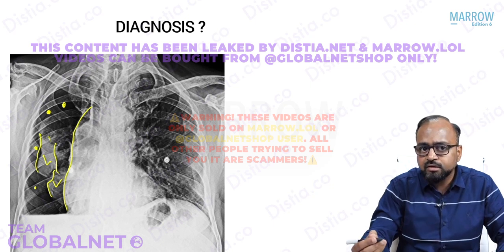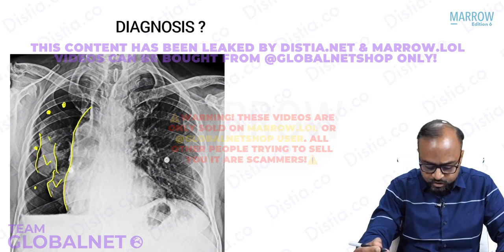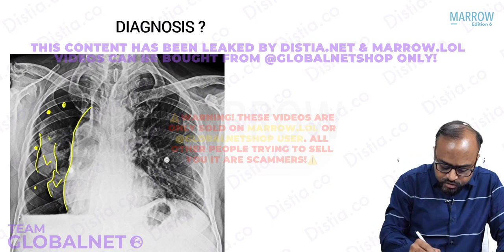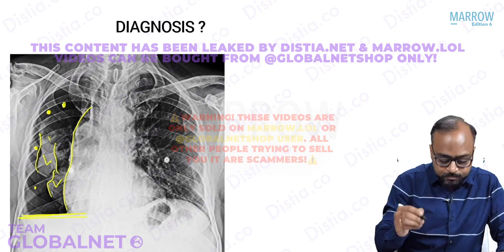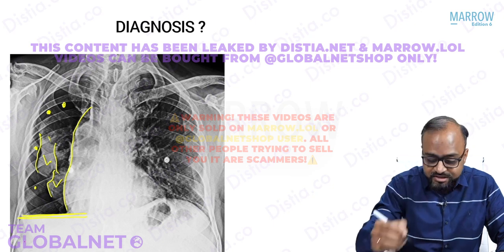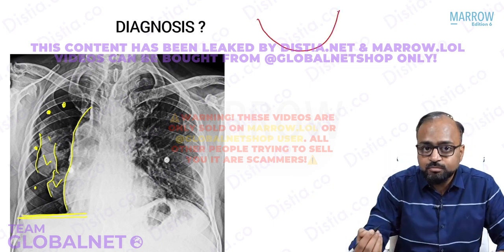But here, though this looks like pneumothorax, look at the dependent part. Can you see the right-sided diaphragm? No. What you see, in fact, is a horizontal fluid level. Do you remember in pleural effusion, I told you that you see a margin of fluid which is very indistinct and like a meniscus like this. That is called the meniscus sign of pleural effusion.